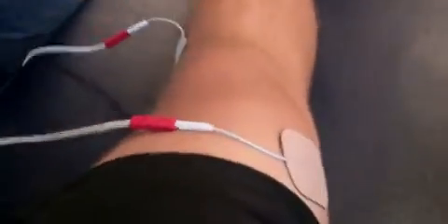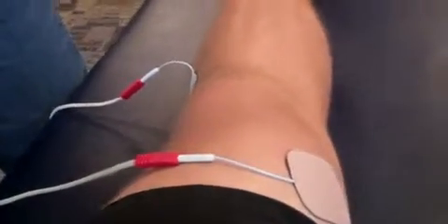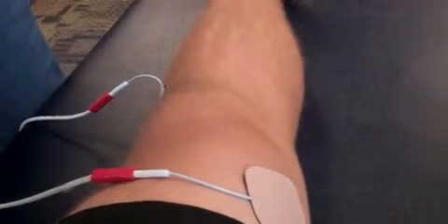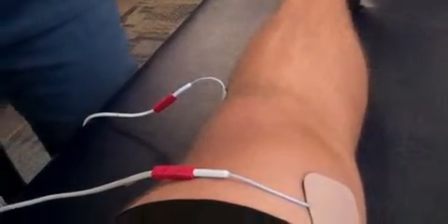This is for pain at a sensory level. We could do this with TENS units, but we'll just start with interferential.